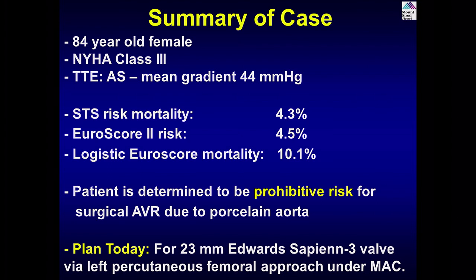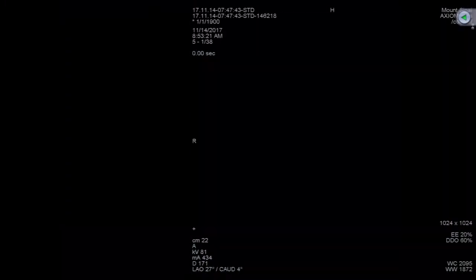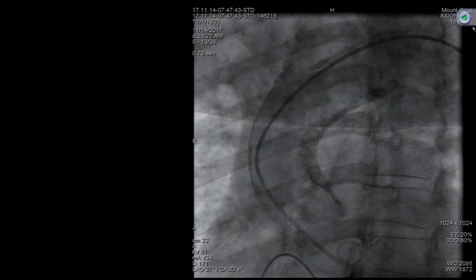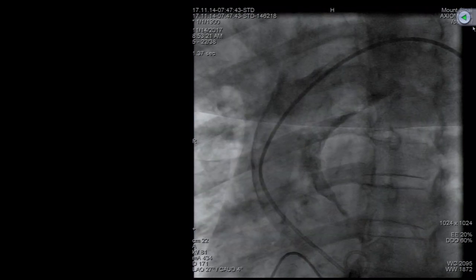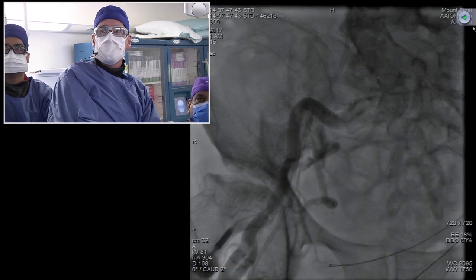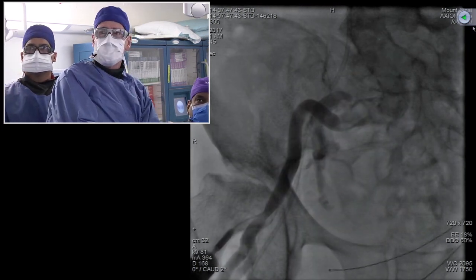Next slide. So to summarize the case, we go ahead now on the MAC with the left percutaneous approach. You show the arterial now. Just to show some further considerations in this case was whether we should actually do an embolic protection device. The innominate, you can see there, is severely calcific where it joins the aorta, and we felt the calcific disease of these vessels was prohibitive for an embolic protection device. We chose the S3 so we could use a no-touch technique around the aorta. To show you quickly the access, you can see there on the right side where we're getting the small sheath, that severe calcific lesion. It's far more stenosed than it appears.